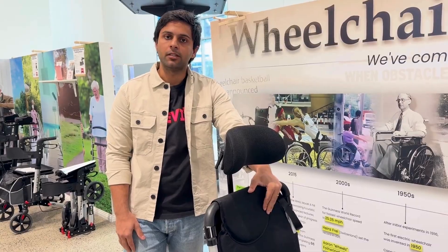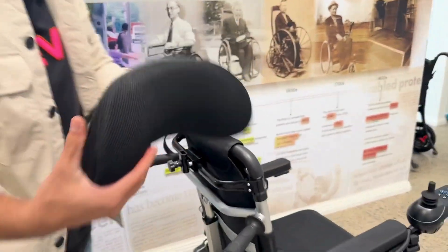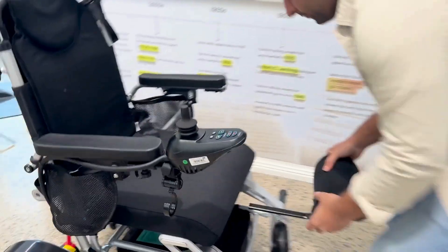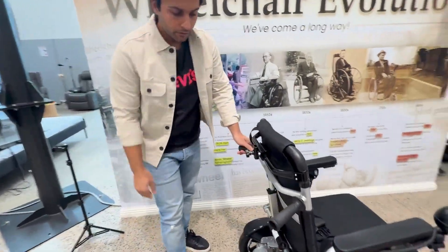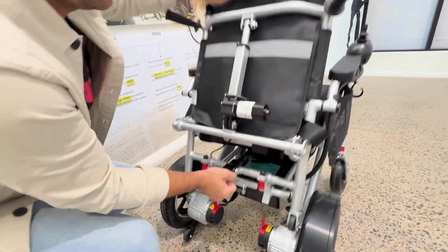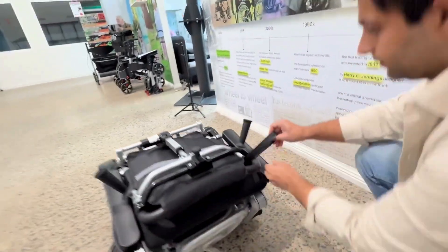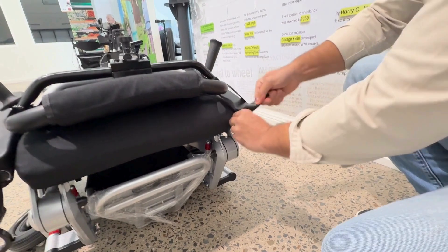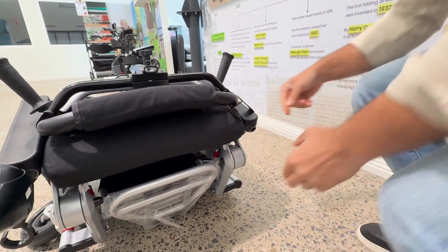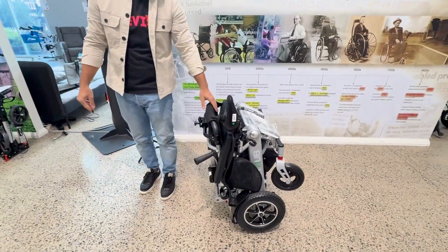Now I will show you how to fold this wheelchair. The first step is to remove the headrest and place it under the seat rest. The second step is to fold the footrest. The third step is to fold the wheelchair using the folding latch. The last step is to secure the wheelchair using this strap.